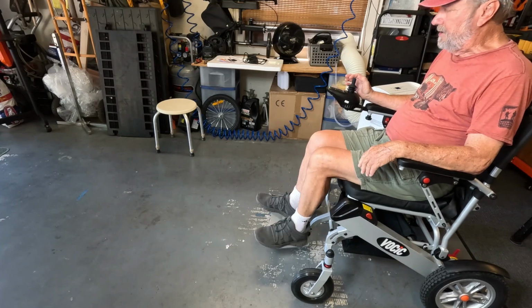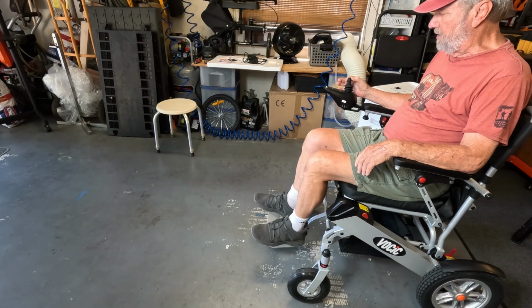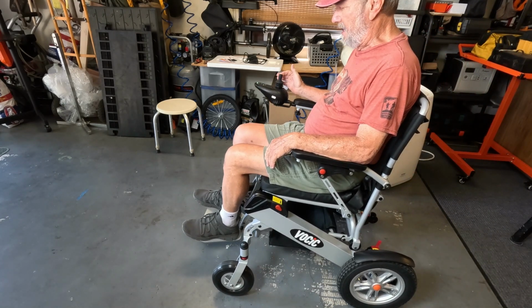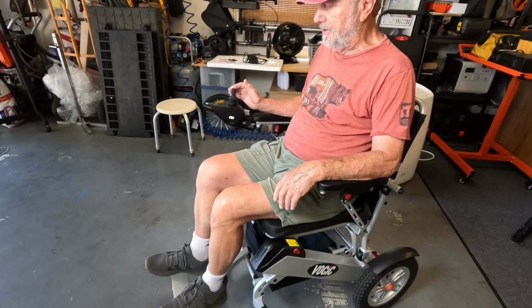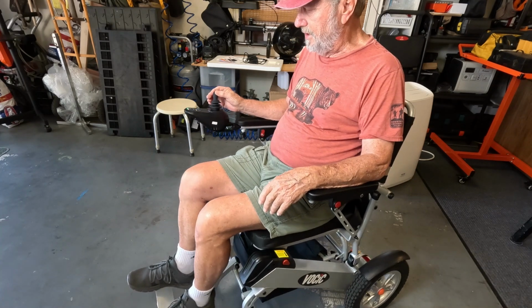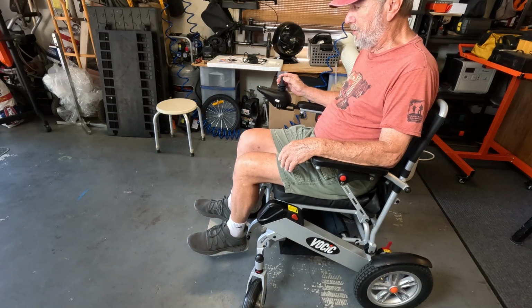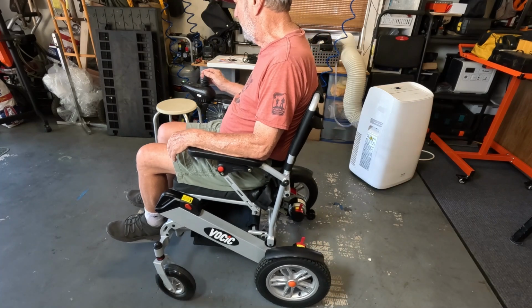Okay, now this is the joystick right here. When I push it forward, it's going to go straight forward. If I move it to the left, I can turn to the left. If I move it to the left and forward, it goes in an angle. And now I can go the other way and back at the same time. So you can maneuver around, and yes, you can even go in a full circle.